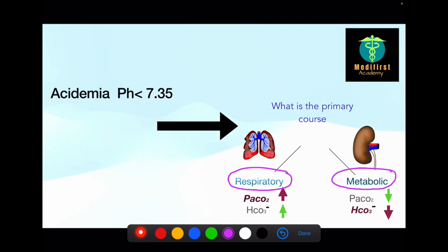In respiratory acidosis, you can see your partial pressure of carbon dioxide on the higher side. That's why I have mentioned it here. Our body has a very beautiful compensatory mechanism. The body just wants to keep your pH at a normal level. Due to some disease, you are accumulating more carbon dioxide and bringing your pH to the acidotic side. Then our body tries to compensate by accumulating more bicarbonate. That's why your bicarbonate in the ABG is also going to be high, which I have mentioned here.